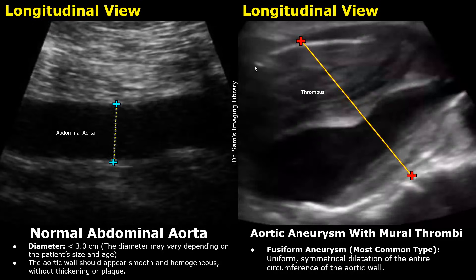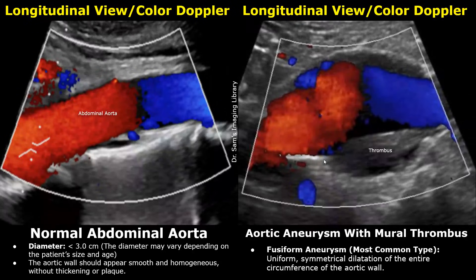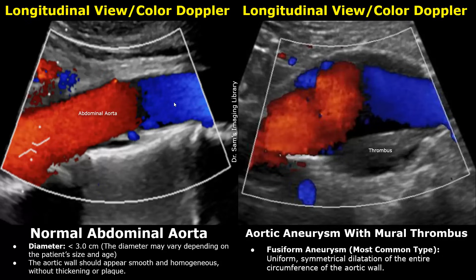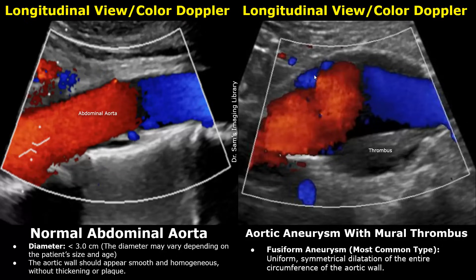This is another case of a fusiform aneurysm with a large echogenic thrombus attached to the aortic wall, narrowing the lumen. These are longitudinal images with color Doppler applied. The normal flow in the aorta is laminar — we do not see any color mixing. In the image on the right, the aorta is dilated with an echogenic thrombus seen attached to both aortic walls. There is some mixing of colors on color Doppler within the aneurysm, indicating that blood flow is disturbed and blood is not moving in one direction.